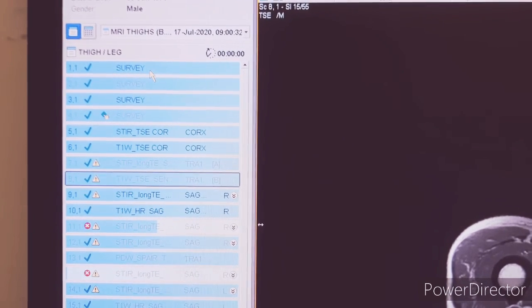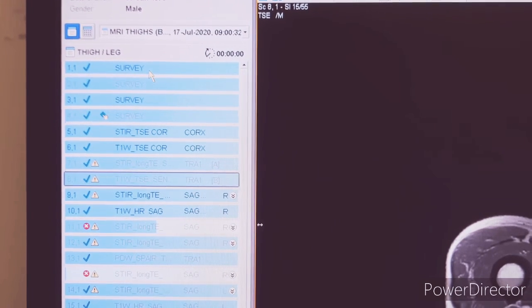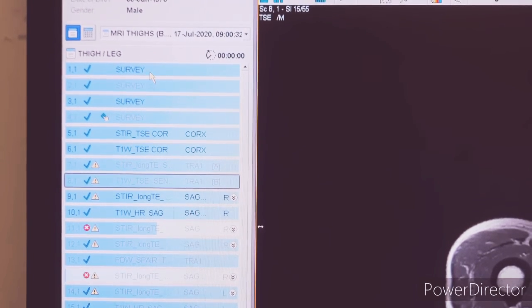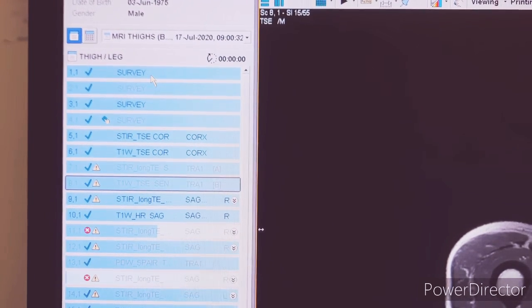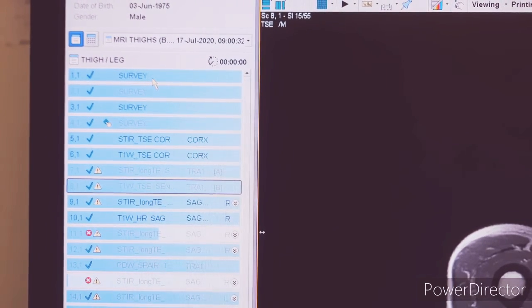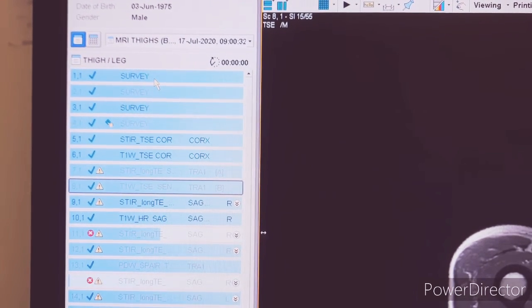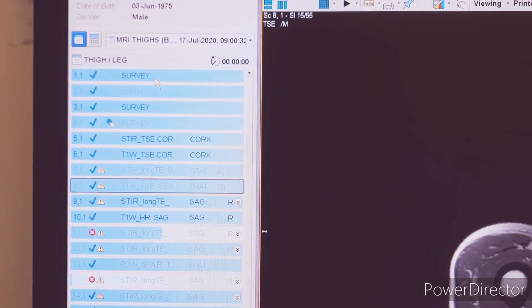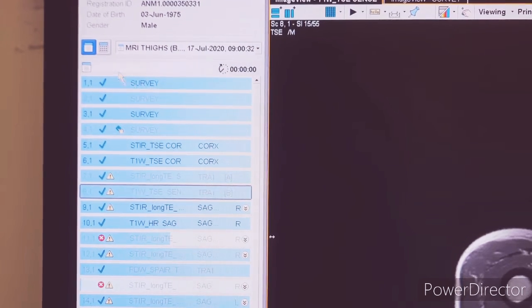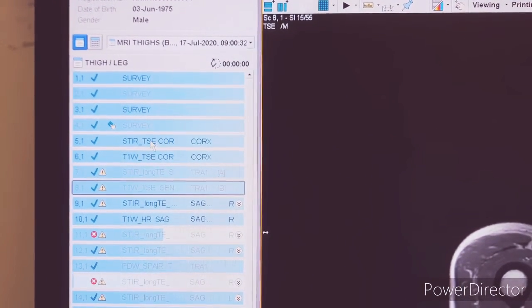Hello friends, today we will see MRI both thigh. The position we have kept here is supine feet first. We can give position supine head first as well, but supine feet first position is way more comfortable than supine head first. We have used a body coil.